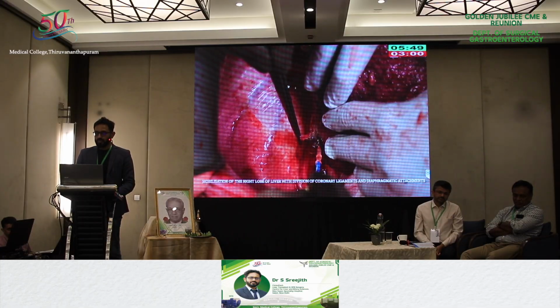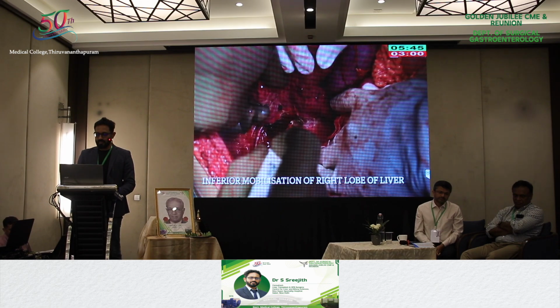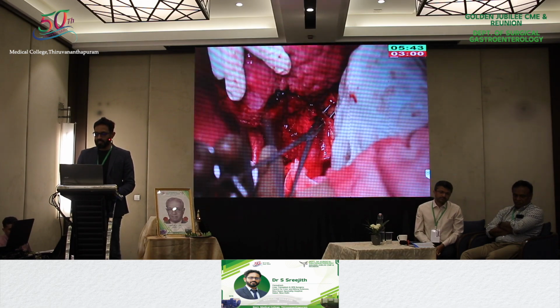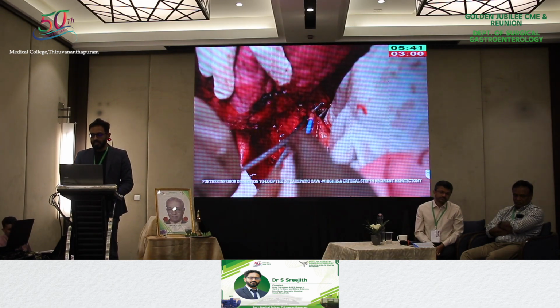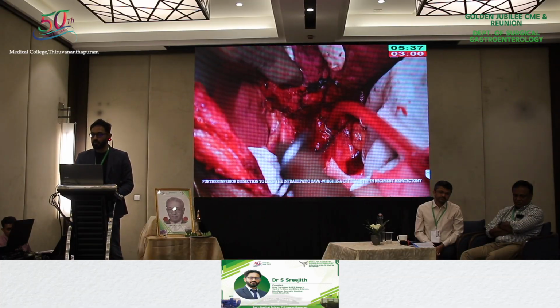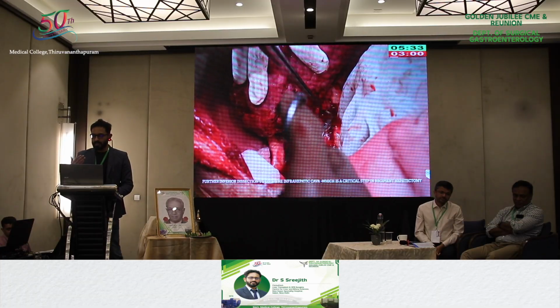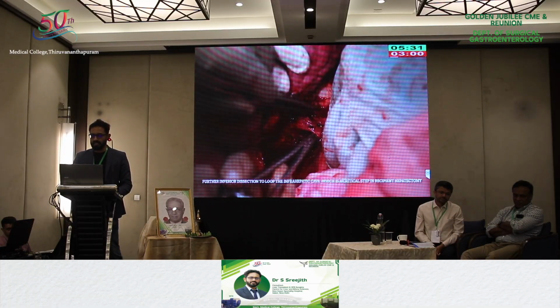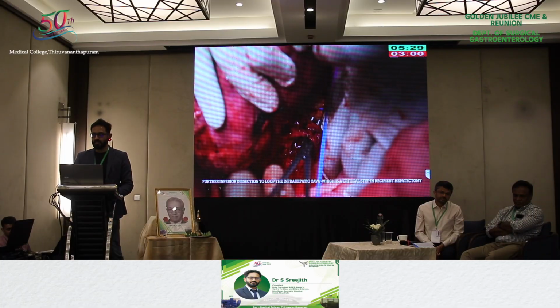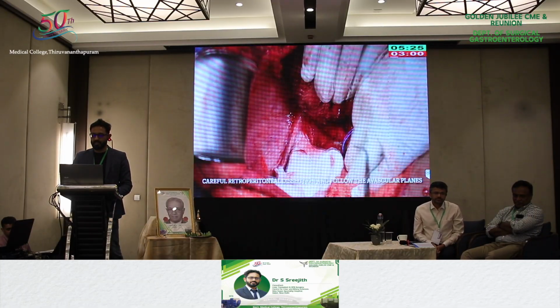We have encountered post-operative bleeding in many of these situations. Now we go for right lobe mobilization. After that, the inferior mobilization. Once the cava is seen, we need to loop the cava. So this is a critical step. Once the suprahepatic and infrahepatic cava control is there, even if we experience any torrential bleed, under total vascular exclusion we can just take the liver out.